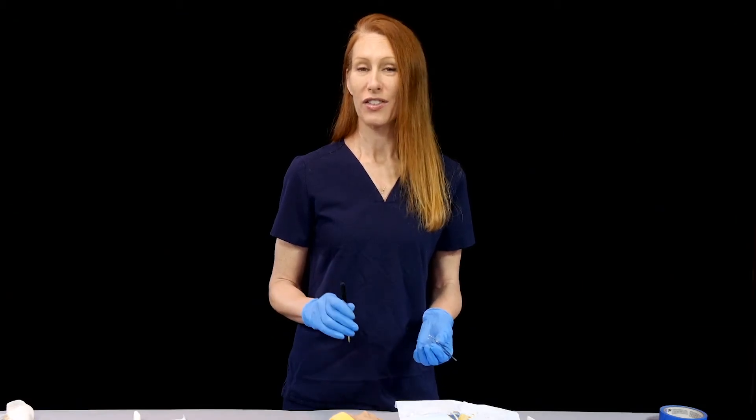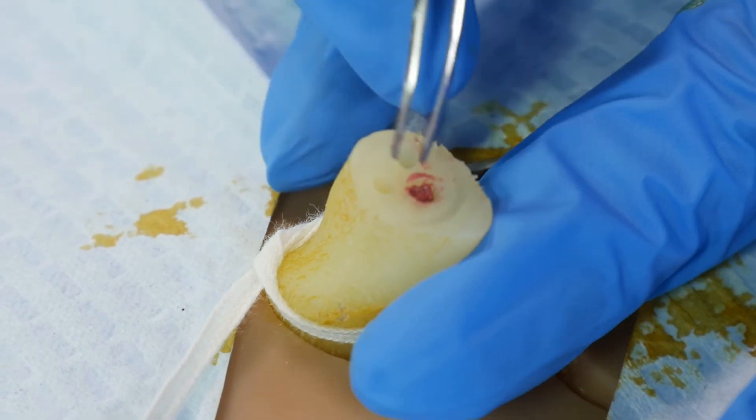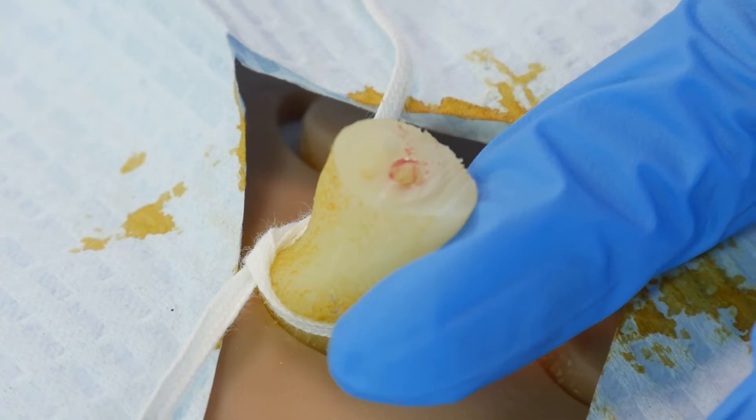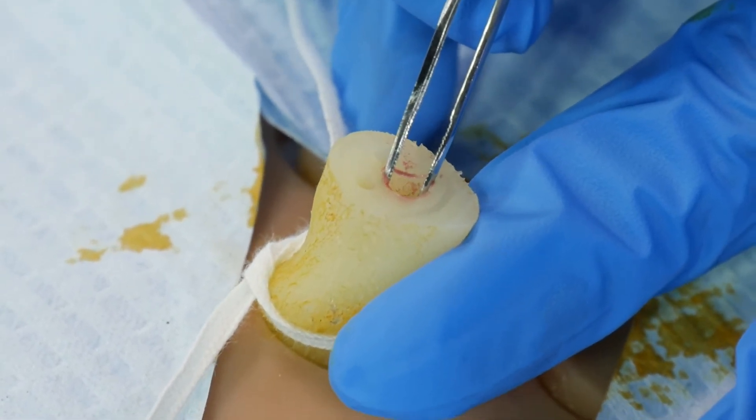Our goal is going to be to cannulate the umbilical vein. Once you've found the umbilical vein, it may still be a little bit difficult to cannulate. There might be clots that you need to remove, and you might have to take a little time to use the narrow forceps and dilate up the size of the vein as it is closing.